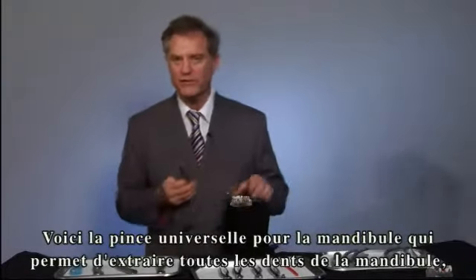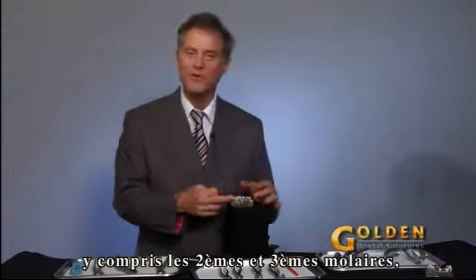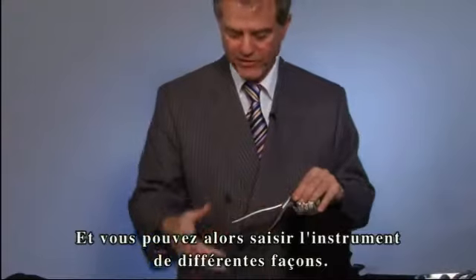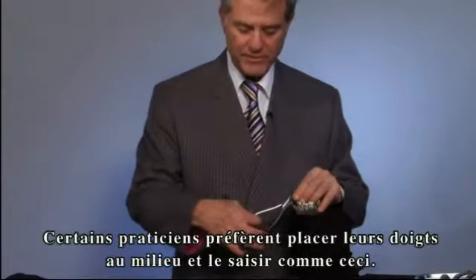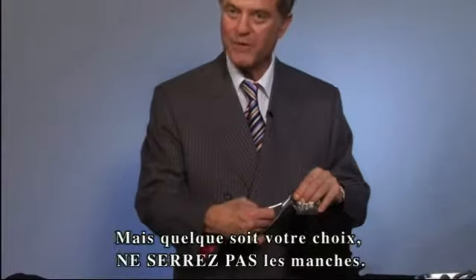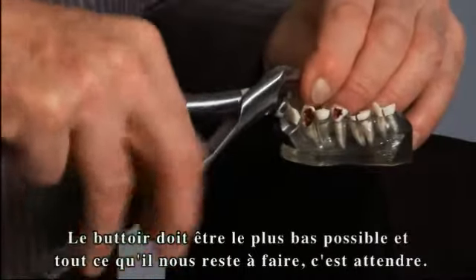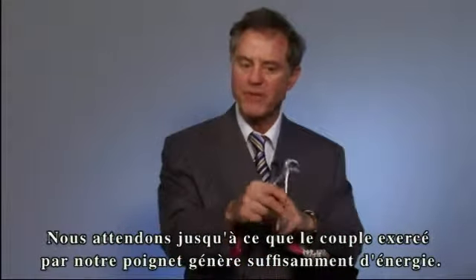This is one universal lower. All lower teeth — if you can get to them, including second and third molars — can be taken out by the lower physics forceps. This is an anterior tooth. You put the beak and then the bumper. You can hold the instrument various ways — this way, or with fingers in the middle. Whatever you do, you cannot squeeze the instrument. This is locked on. The bumper should be as far down as possible, and all we do is wait, using torque from our wrist.